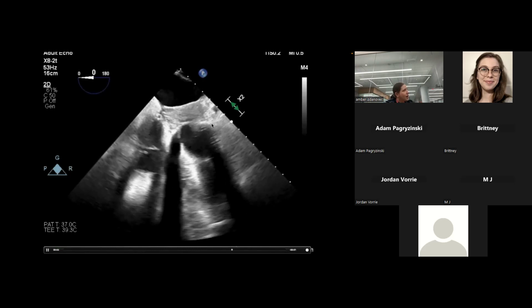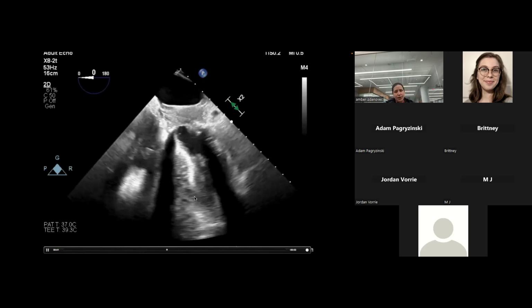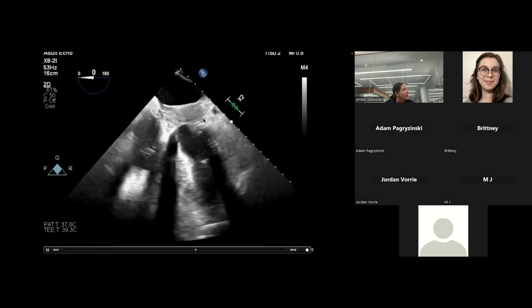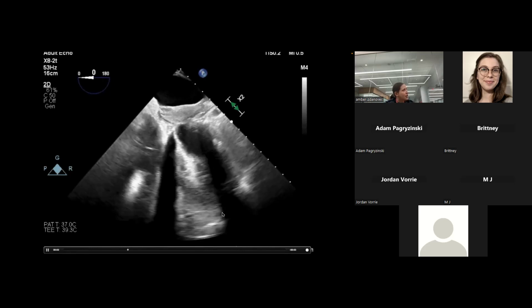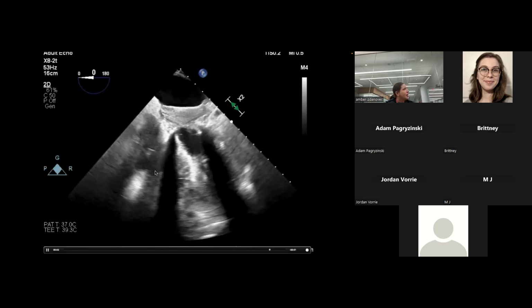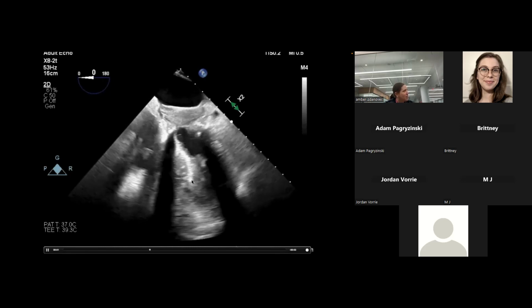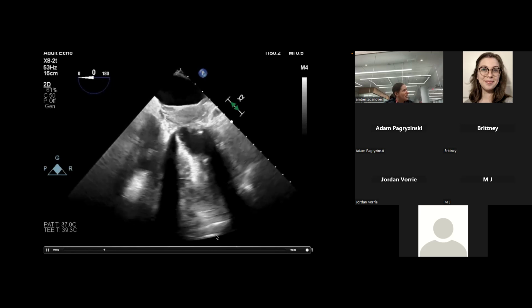Maybe mitral there. Mitral, yep, and you can actually use the fact that she's had a mitral valve replacement to orient you, because this is probably one of her mitral valve struts, and this is probably her other mitral valve strut. You see how those drop out right there? Okay, so this would probably be the interventricular septum, maybe around here. What would that make this chamber up here?